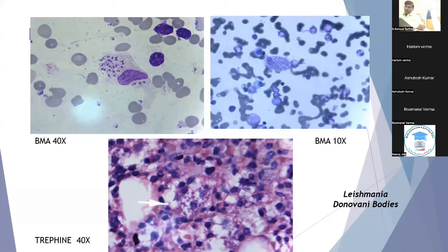the plasma cells in the marrow. The peripheral smear will show monocytosis. So from the peripheral smear, from the CBC, from the bone marrow aspirate, by looking at all the lineages of the cell, we must try to pick up the clue regarding what is happening in the marrow.